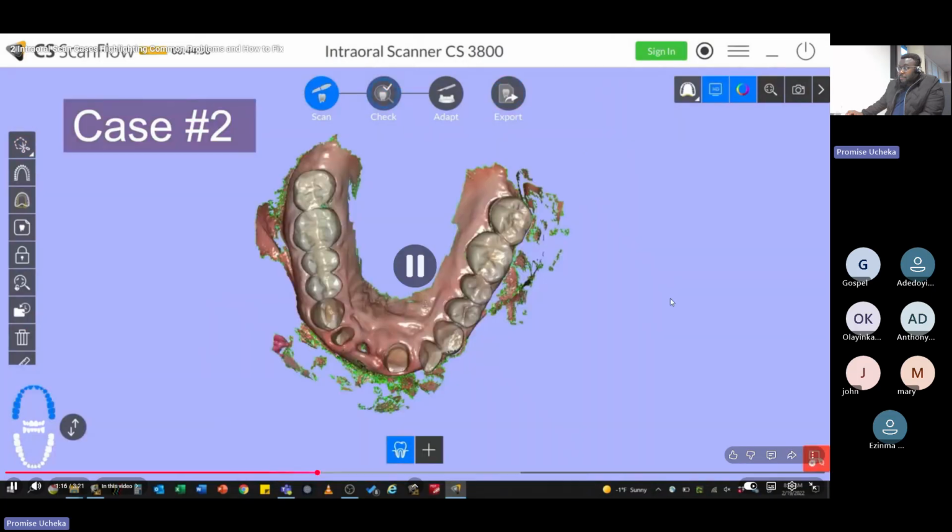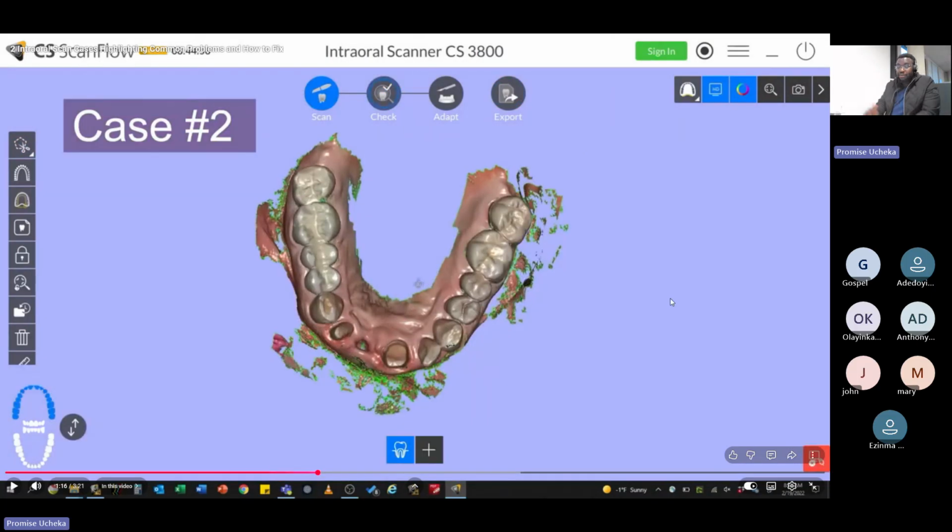And this will prevent that back and forth that goes on between the dentists or the clinicians and the people that work in the lab. When the lab rejects your impression and says this model is not good enough, they send it back to you, and because you know that the patient is gone, you might insist that it is good enough and that the lab should use it like that. So here, either you identify that problem and fix it, or maybe the lab can even do the fixing themselves in certain cases.